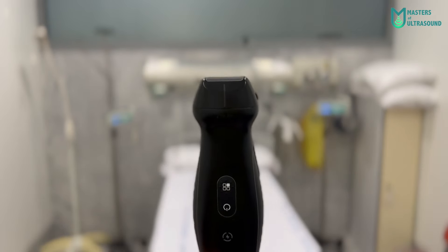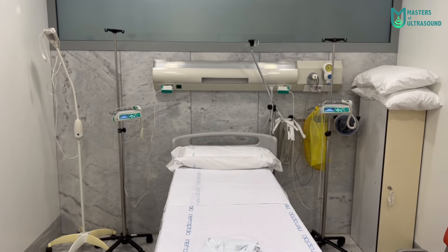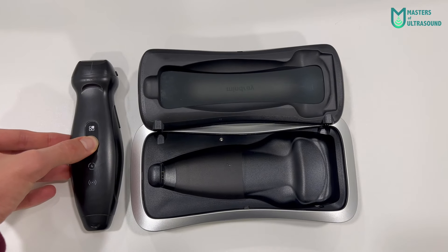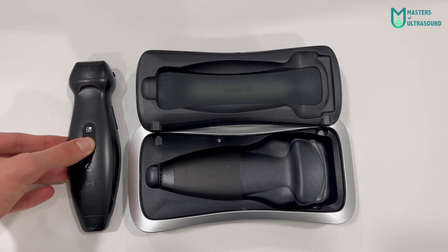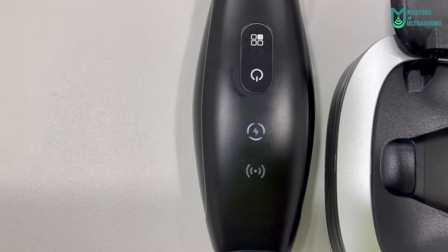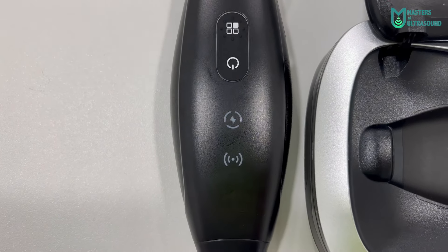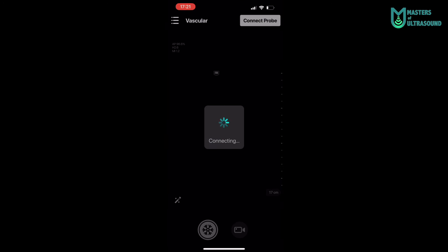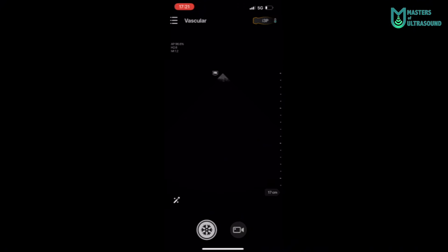Now let's move to the inside and see the boot-up process. Just pressing the power button for a few seconds, you can see the light indicator below. Now that it's flashing, we can connect wirelessly to the phone via the app. We press connect and it will ask us to pair both devices, and after a few seconds it is ready to scan.